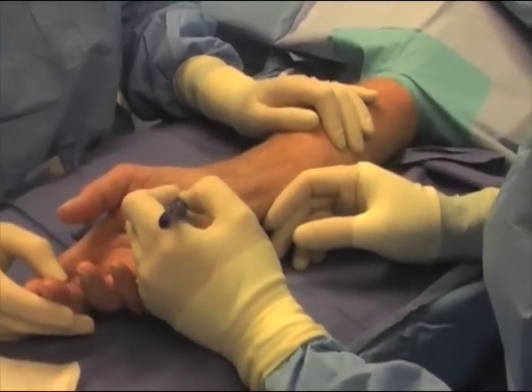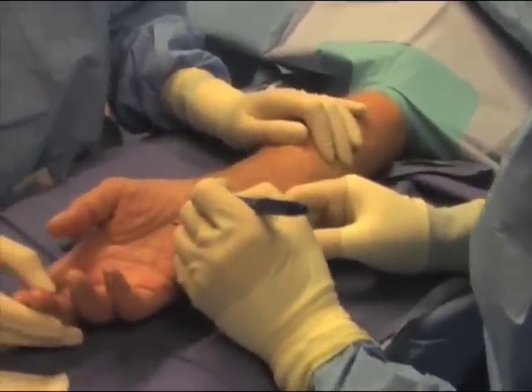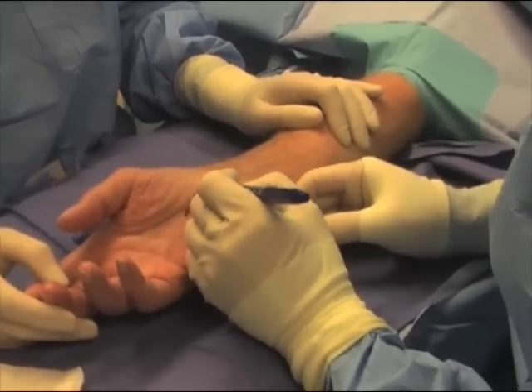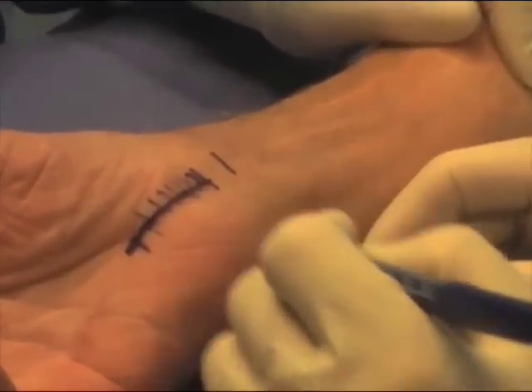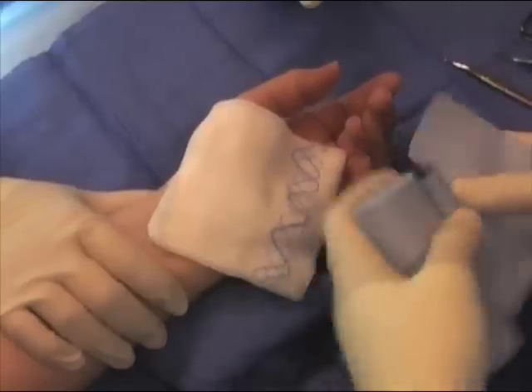First, the endoscopic carpal tunnel incision is marked on the skin — it measures about a quarter of an inch in length. Next, we're depicting where the transverse carpal ligament lies and the traditional open carpal tunnel surgery incision if this were to be used.